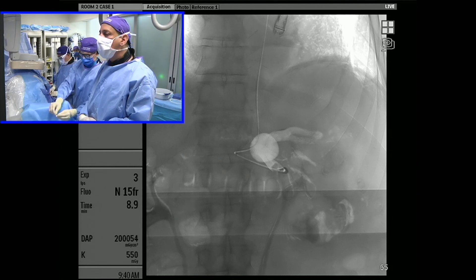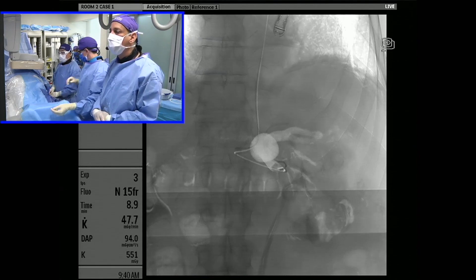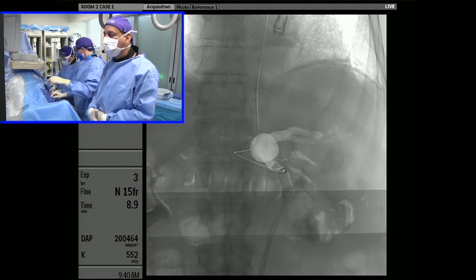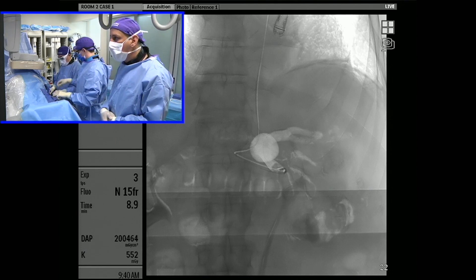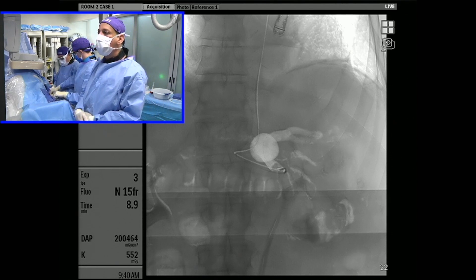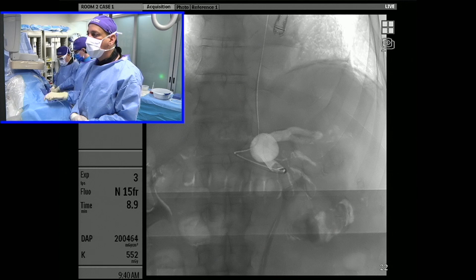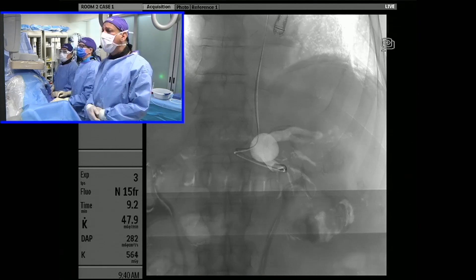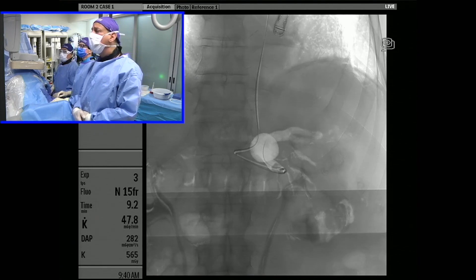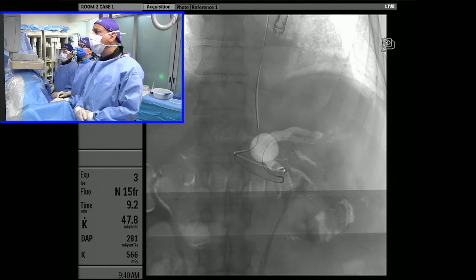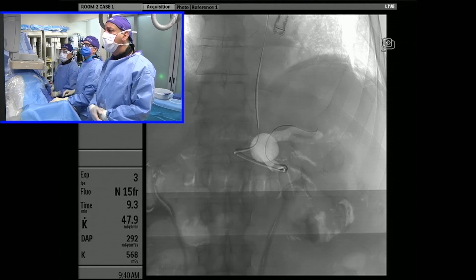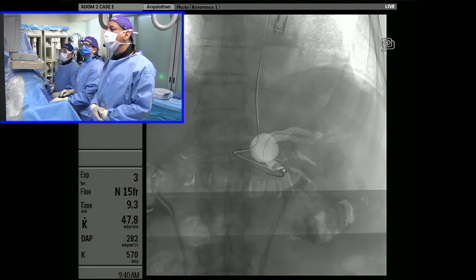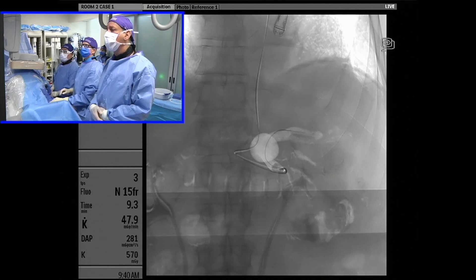We've only got about 10 to 15 centimeters of microcatheter outside the patient's wrist, which from my perspective is a very comfortable working length ergonomically. You can see the coil actually exiting the microcatheter now, and we're going to see if we can get it to land right at the bifurcation.